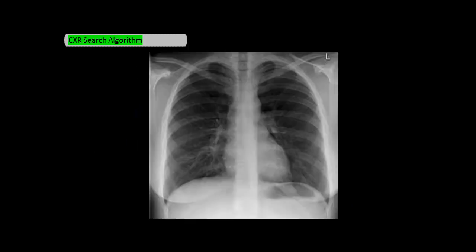First up is A for airways. You want to look at the trachea and make sure the angle of the carina is not too open or closed, and that the trachea is at the midline. You want to make sure it's centered and not shifted in either direction.